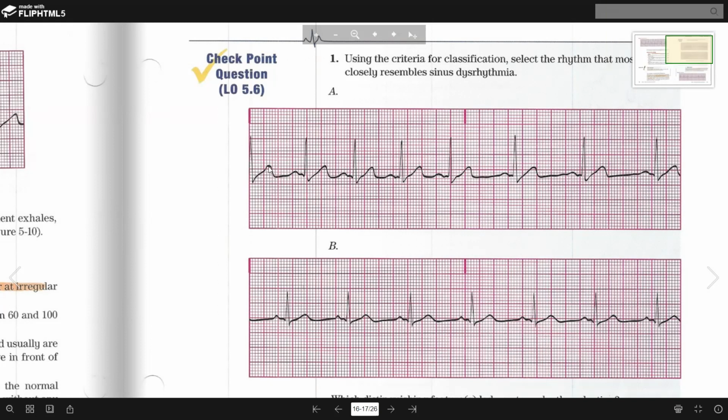No, this is the T wave, okay? Remember, the P wave is before the QRS. Here it looks like the QRS is here, so that means this is your T wave, and then you have a P wave. See, P wave, QRS. P wave, QRS, and then your T wave over here, okay? PQRST. Got it? All right.